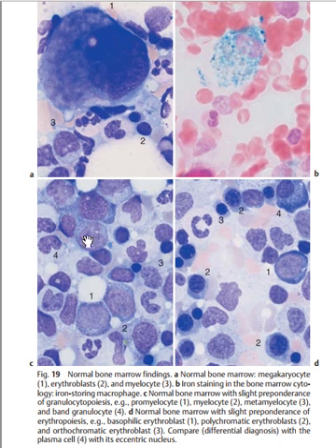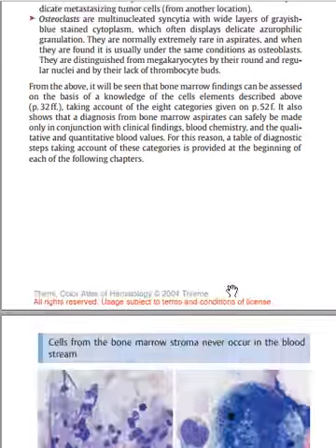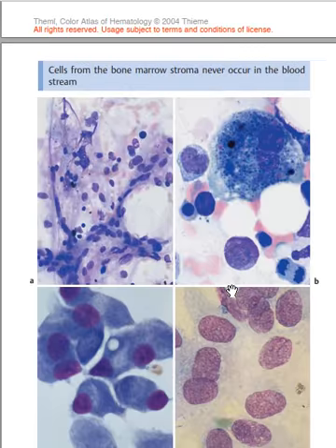Now the next one here is diagram C. You have normal bone marrow. In the normal bone marrow cell here you can visualize adipose tissue. This is the erythroblast. These are the pro-myelocytes and the myelocytes here, and this is a similar pattern in this diagram here.